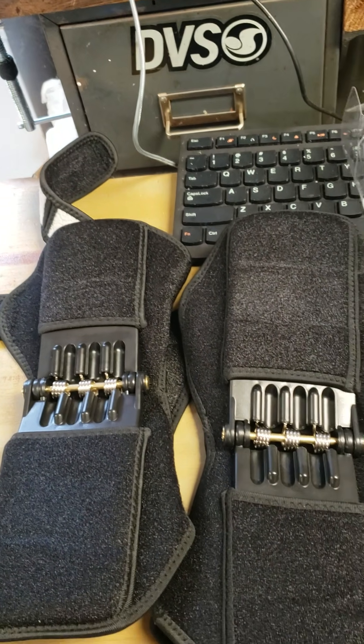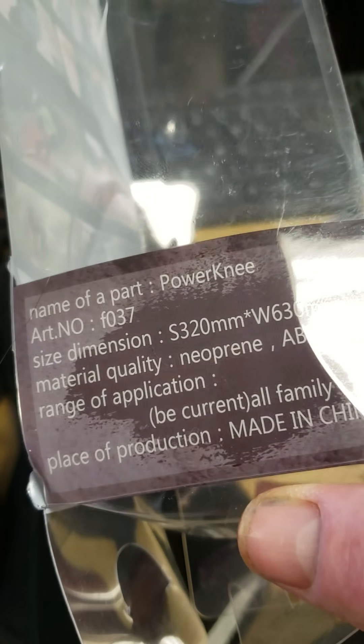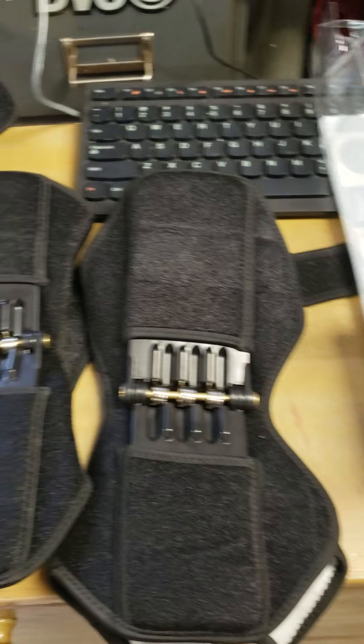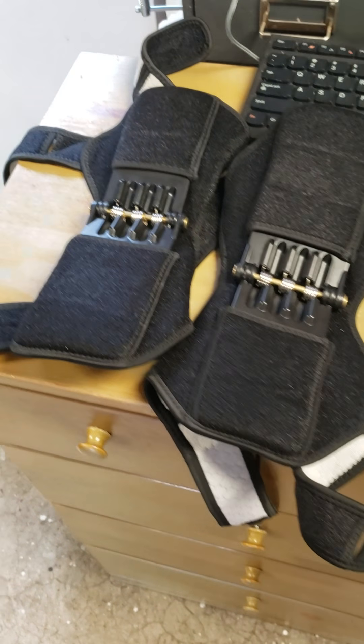I wouldn't buy these. It's one of China's best — made in China. And I'm not putting everything down that's made in China; we all have tons of stuff made in China. But these are garbage, man. They do not work.